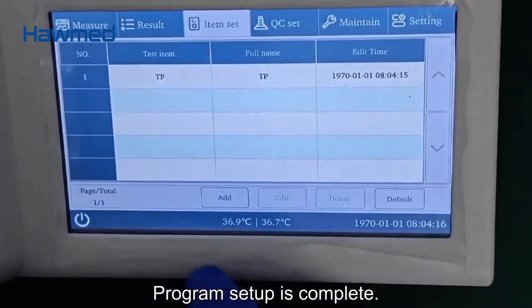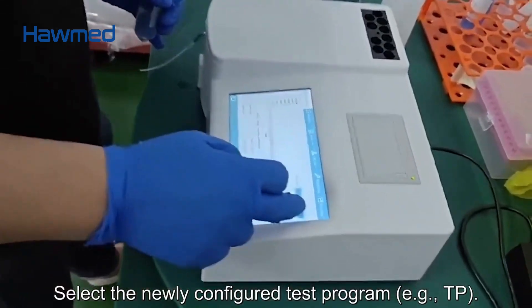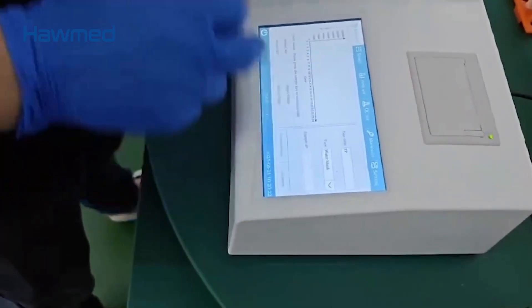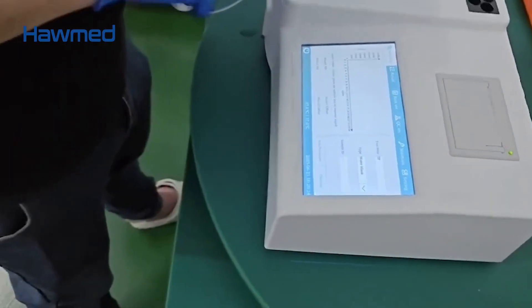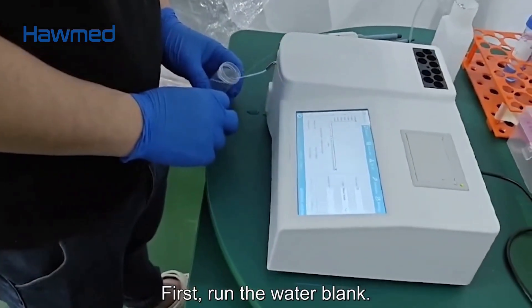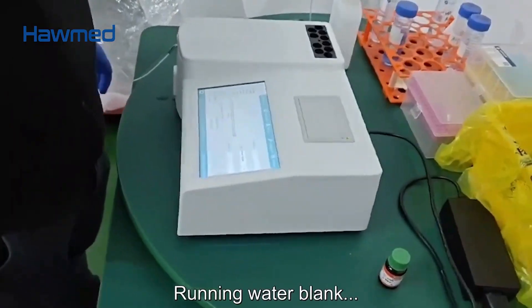Step 4: Reagent preparation, incubation, and testing. Select the newly configured test program — for example, TP. First, run the water blank.